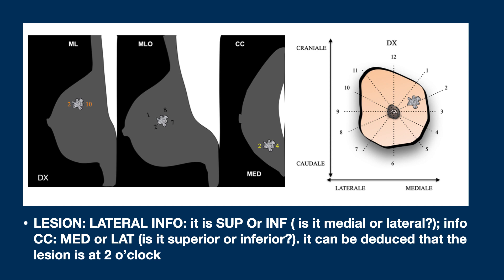Therefore, having the two standard projections plus the lateral projection, it is possible to locate a lesion exactly. From the lateral projection, I know that the finding is in the upper quadrant, but I don't know if it is medial or lateral — a question solved by the CC. The lesion is therefore located at 2 o'clock.